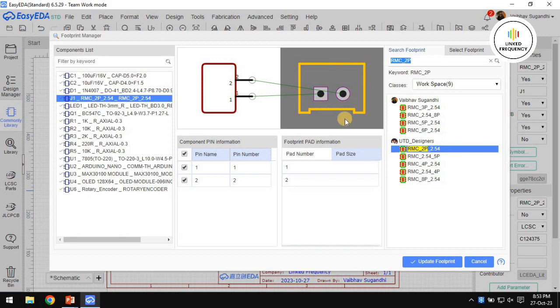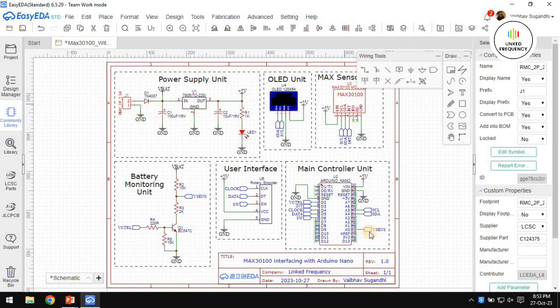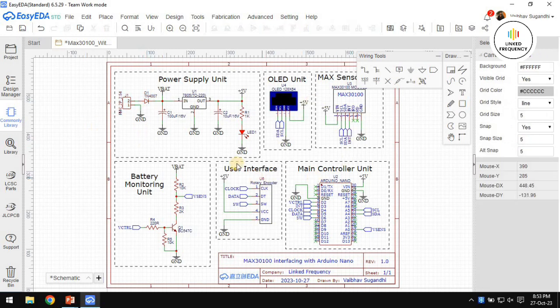It is a one-way insert connector, so it is just not possible to insert it the other way. That is the first level of protection against reverse connection of the battery with the electronic circuit. But in the worst case scenario, if even that happens, this diode will save our entire electronics. Just a 1 rupee diode will save the entire electronics, which costs more than 5,000 rupees.